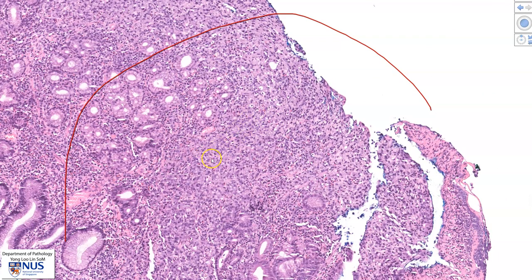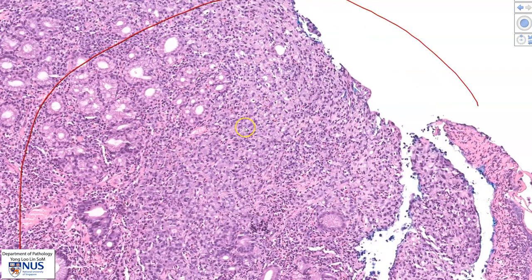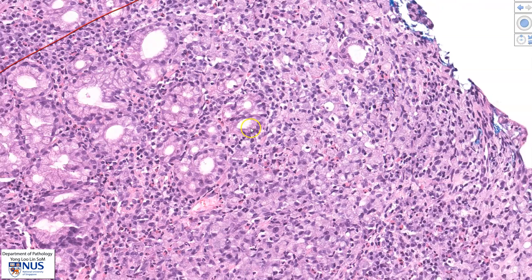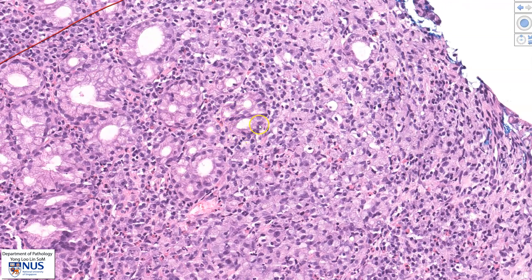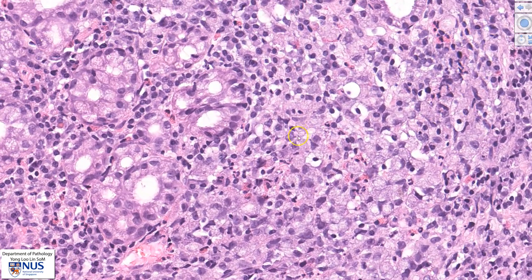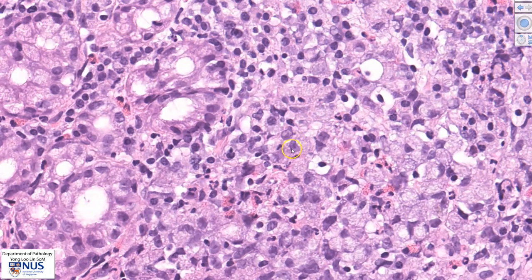Zooming in, we see that there are sheets of cells within the lamina propria and these do not form glands. Here we still have benign native gastric glands, while these are the sheets of malignant cells. The nuclei of the malignant cells are slightly larger, but not much larger than those of the benign gastric glands, and these nuclei appear irregular.